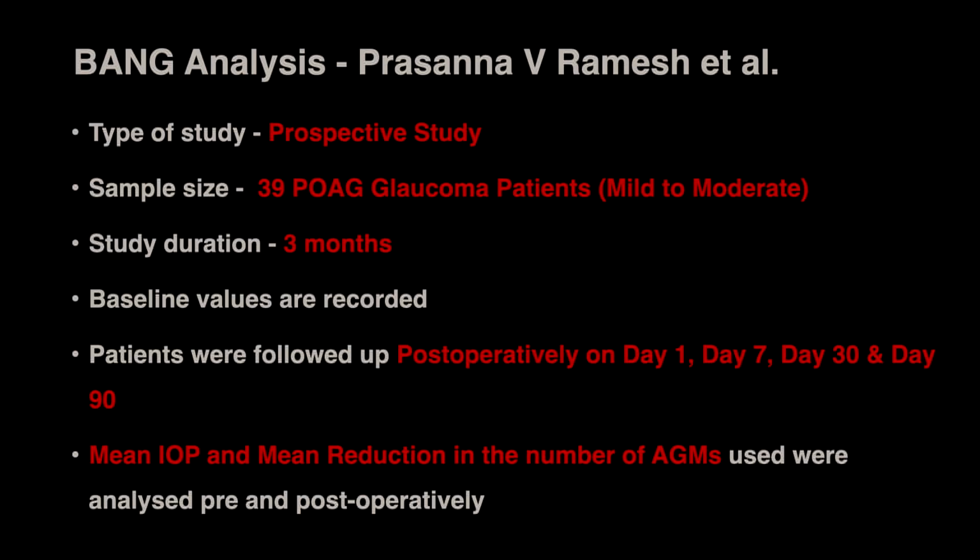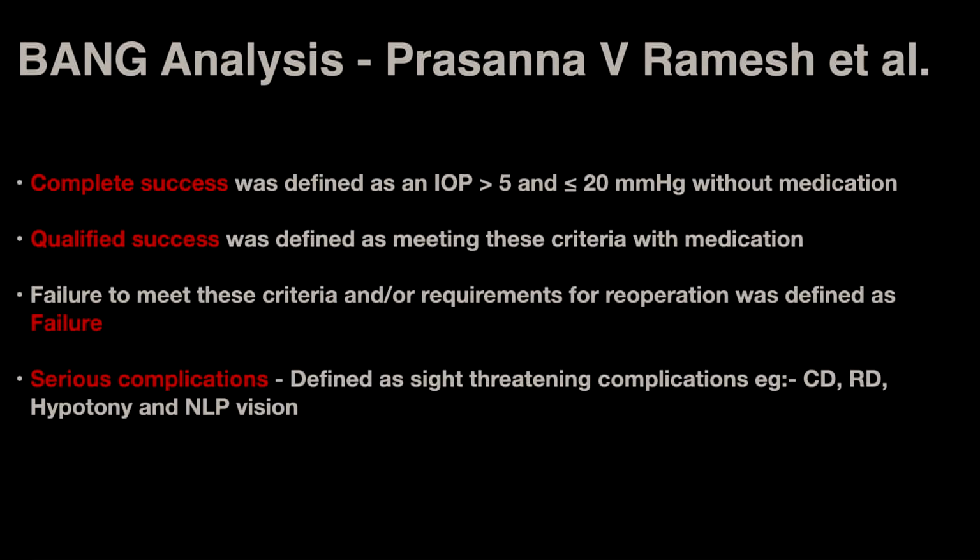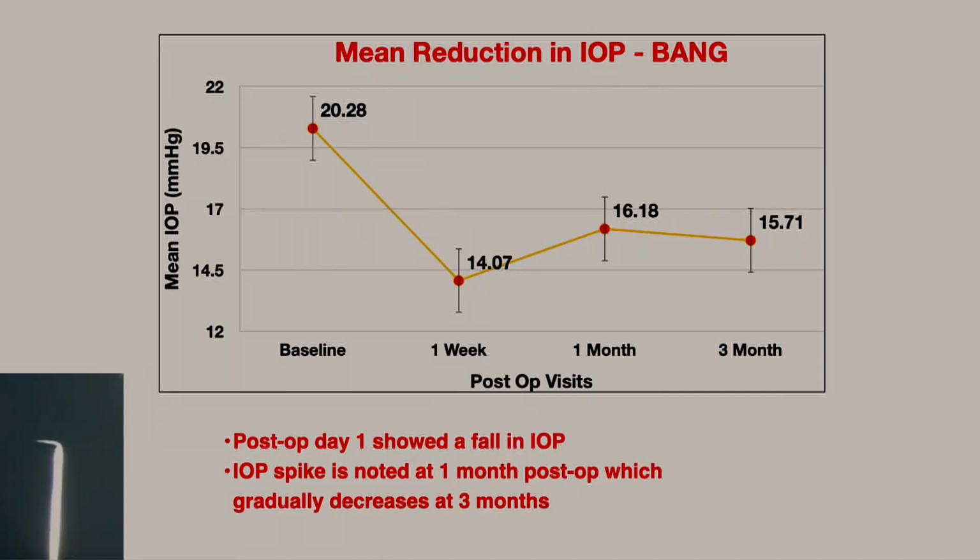We did analyze our data, and now we have more follow-up of 6 months to even 9 months and 1 year. And the success rates are quite promising even with BANG 2. You can see that this is a drop in intraocular pressure.